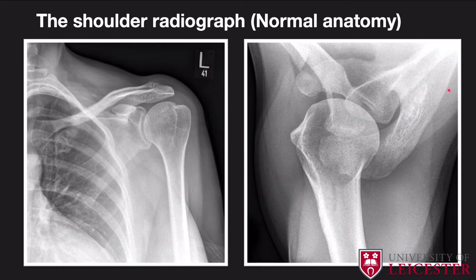On your AP view, the humeral head forms a very subtle overlap with the glenoid — that's a well-centered AP radiograph. There are specific other views that can be obtained; for example, you can get it specifically orientated so the anterior and posterior lips of the glenoid are perfectly aligned. We call this the Grashey view, which may be specifically looking for degenerative change or abnormalities within the glenoid.